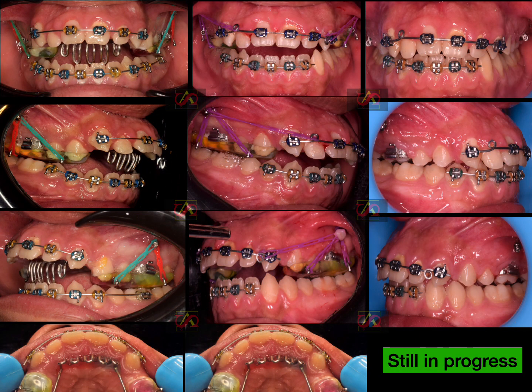After progress of the treatment, the open bite closed slightly, and then after that closed completely, and then I removed the appliance. It is still in progress, and after that we will bond full arch upper and lower, closing the upper right spaces and upper left spaces, and this also gives me deepening of the bite more and more, and corrects the inclination of the proclined upper incisors.